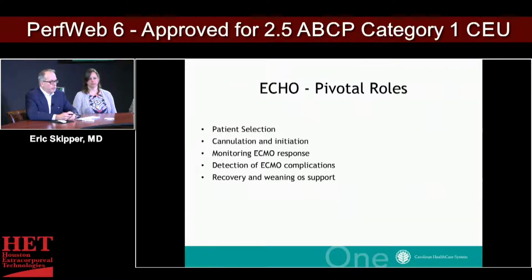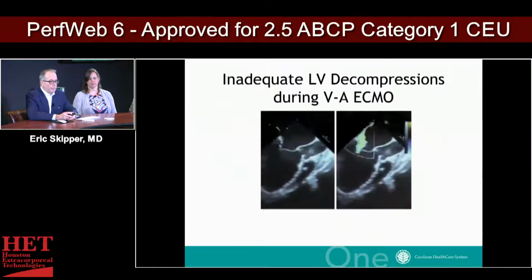Sometimes those complications might include thrombus, intracardiac thrombus. Sometimes they might just indicate that you're not really draining the heart as well as you should and you're not really setting that heart up for recovery. It helps with recovery and weaning of support as well.